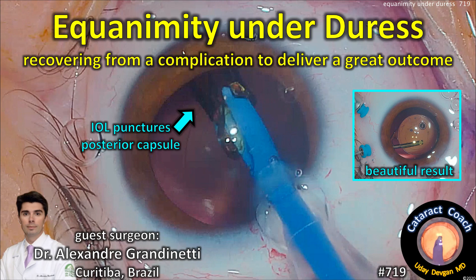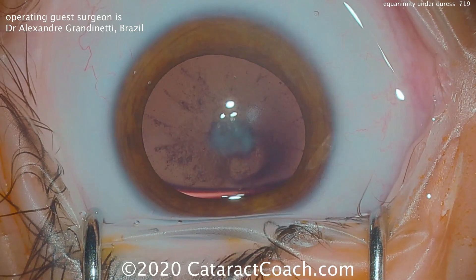CataractCoach.com. Equanimity under duress: recovering from a complication to deliver a great outcome. Our guest surgeon is Dr. Alexander Grandinetti from Brazil.